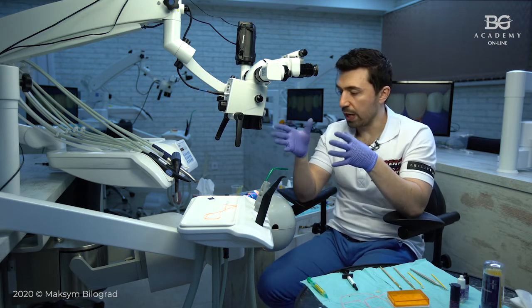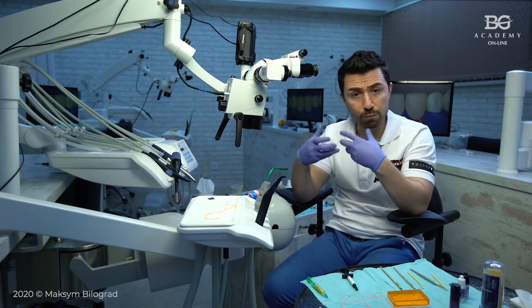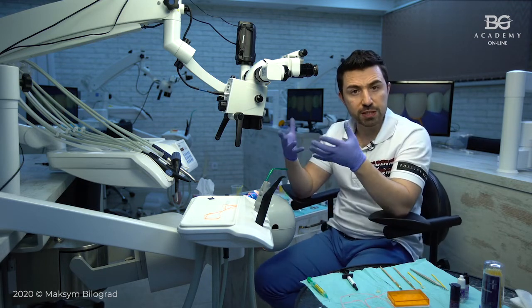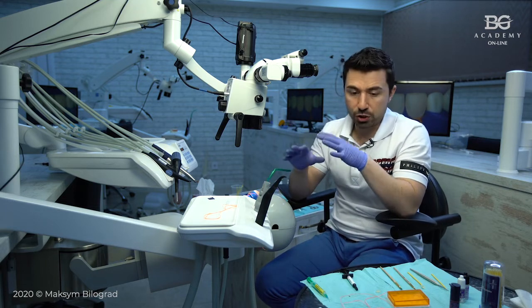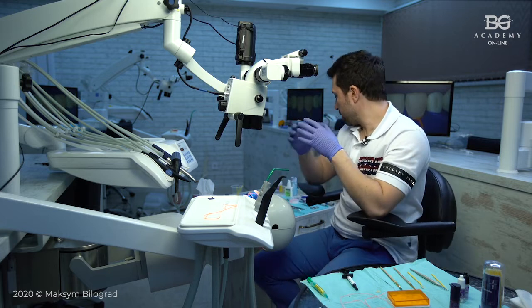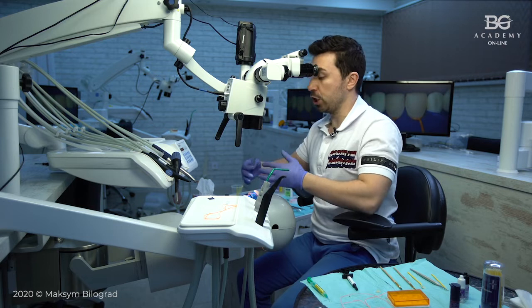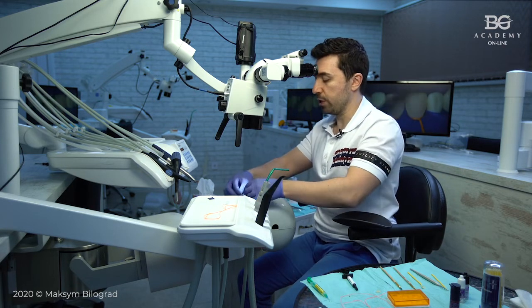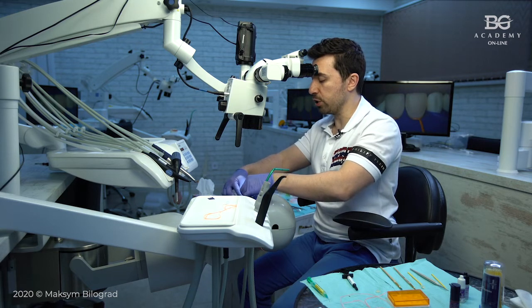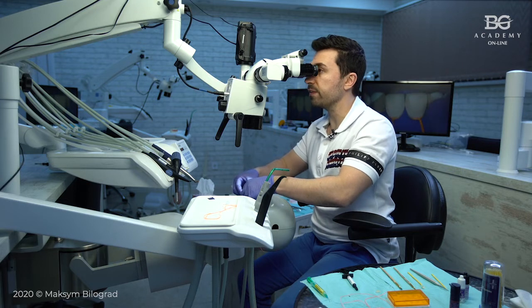And I will show you step by step now how do we prepare surface of the tooth for bonding, considering these different clinical situations. In any single clinical situation that was mentioned, I always do sandblasting. Okay, so if I isolate my case as here, so basically I have several teeth well isolated, I can use sandblaster for group of teeth.